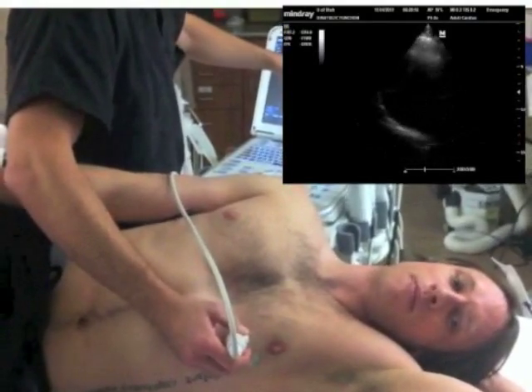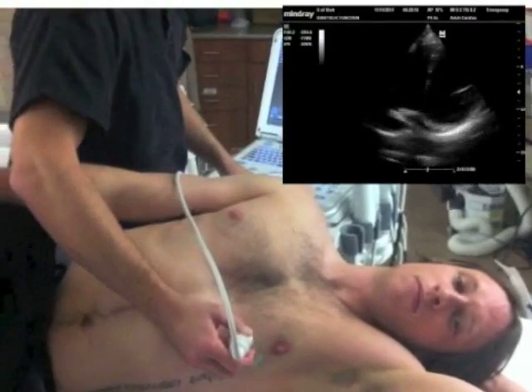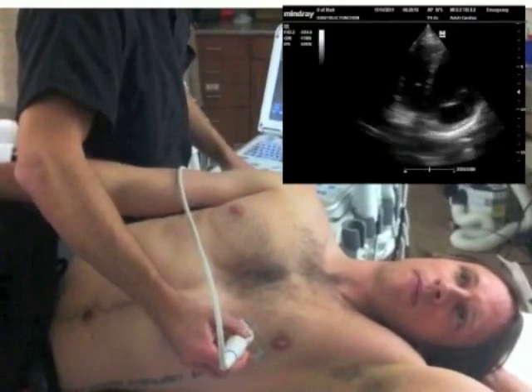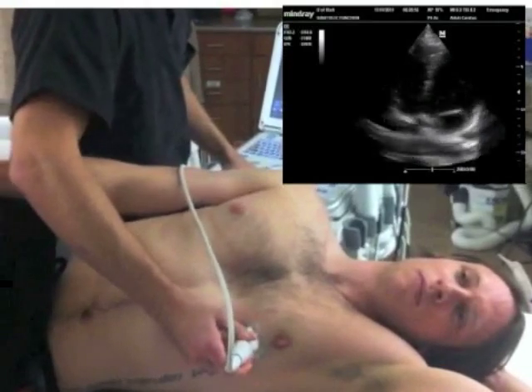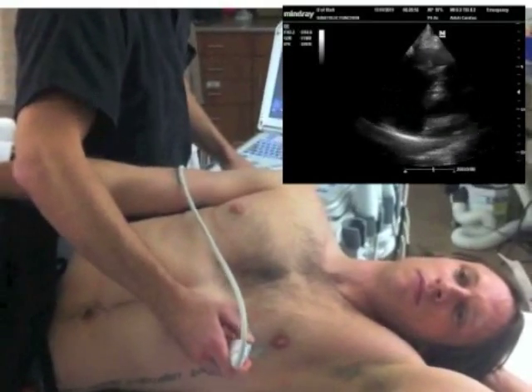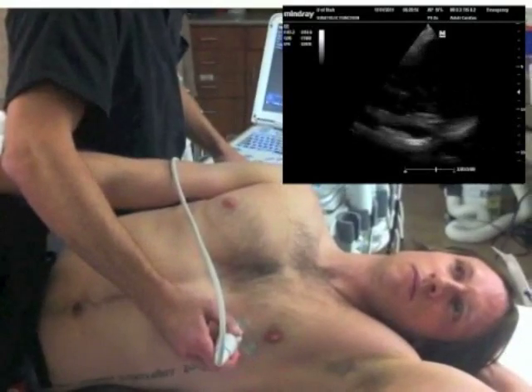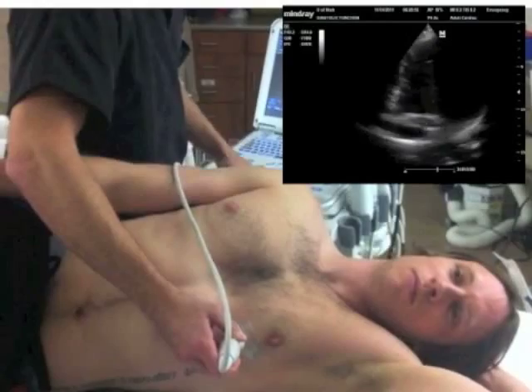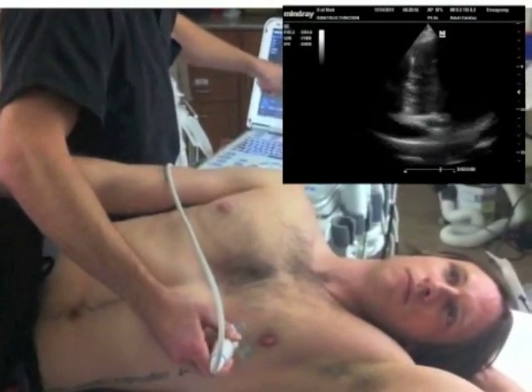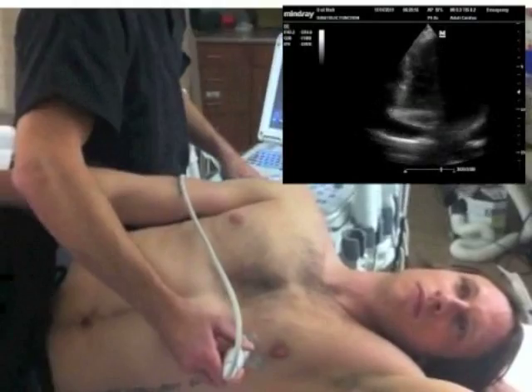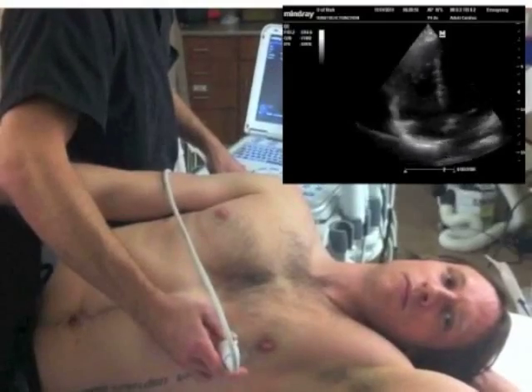So here we see we're getting part of the 4-chamber view — there's the left ventricle right here, part of the right ventricle, and then I can see the atria. So what I'm going to do is flatten the probe down and rotate the probe towards the bed. Usually that clockwise rotation and flattening will really improve my view so that I can see all 4 chambers. So now we see the left ventricle, right ventricle, left atrium, right atrium.